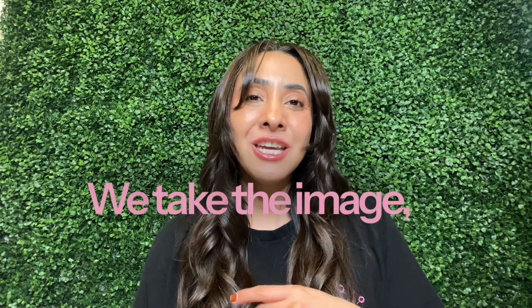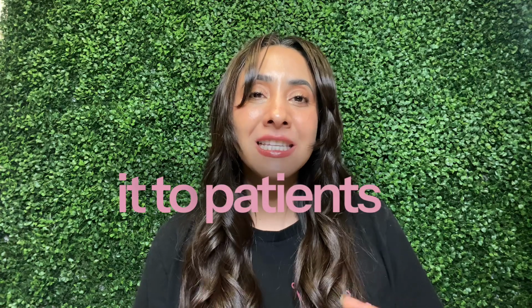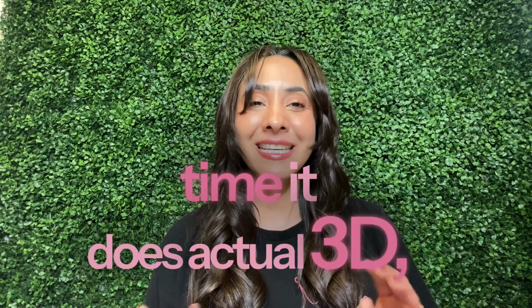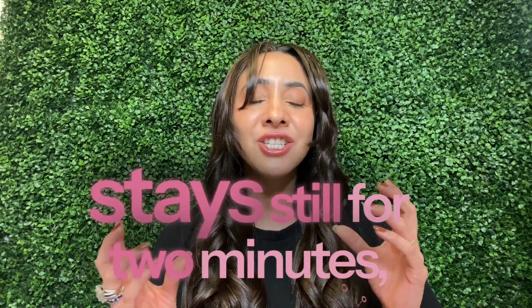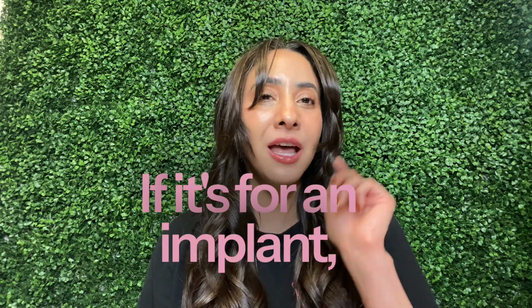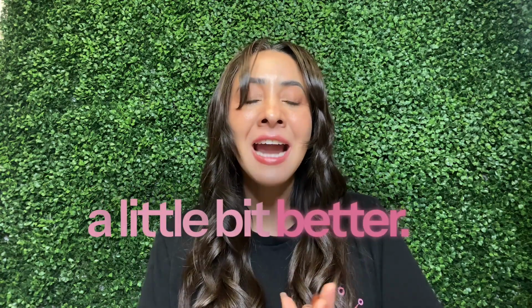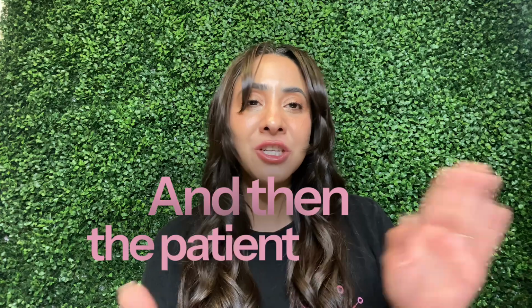We take the image. The way we explain it to patients is that it initially does a scan, which goes around your head. And then the second time, it does the actual 3D. Stay still for 2 minutes, gently bite down. If it's for an implant, we'll put a cotton roll so that we can separate the soft tissues a little bit better. And then the patient sits.